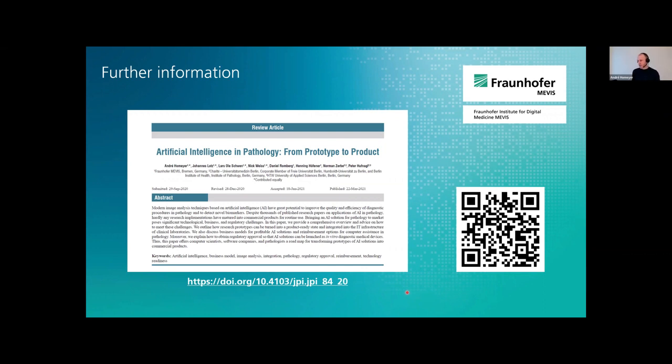And explainability or testing explainability will always introduce some further effort, which reduces the efficiency of the whole pathological assessment process. And maybe if this is too much effort, then AI is no longer economically worthwhile.